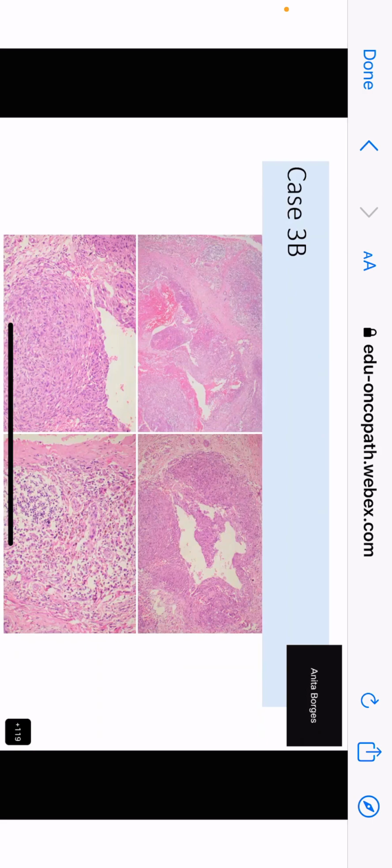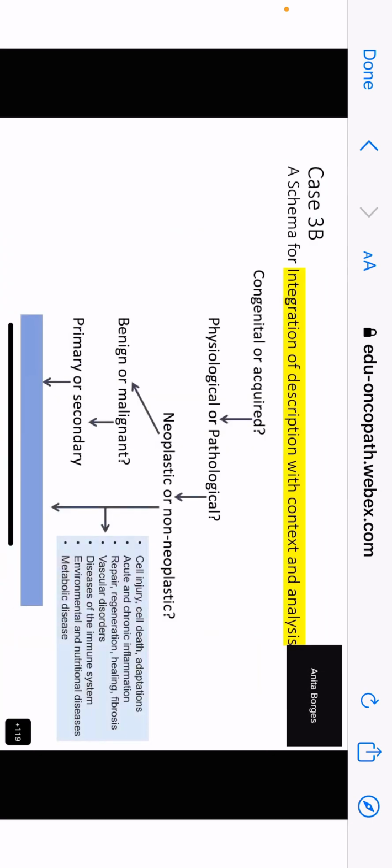See, for anything that has to be of vascular endothelial origin, you should be seeing endothelial cells that are lining something. And if you're all saying that it is benign, then there should be vascular spaces lined by endothelial cells, and they are not there. And you said that they were non-endothelial lined spaces. Okay? So, all right, it is acquired, it is pathological, it is neoplastic. Question is, is it benign or malignant? So let us find out what this shows.